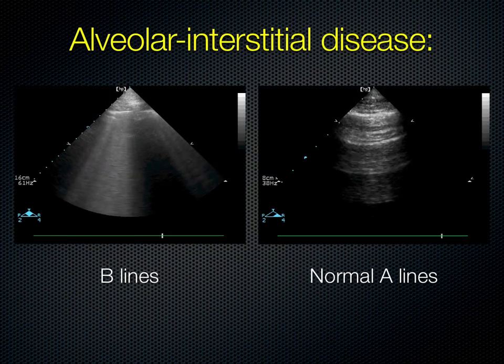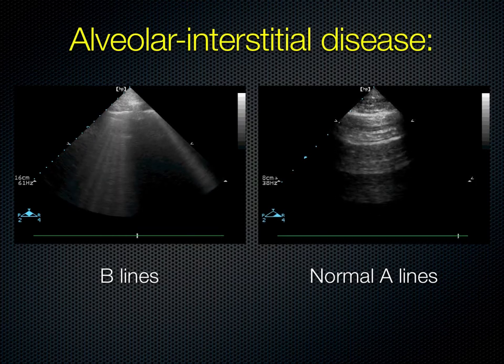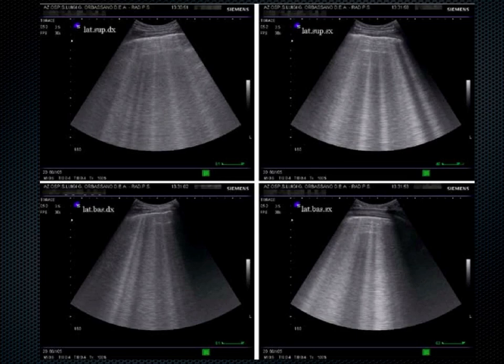Side-by-side comparison of B-lines and A-lines. And another example, some still pictures of what B-lines can look like.